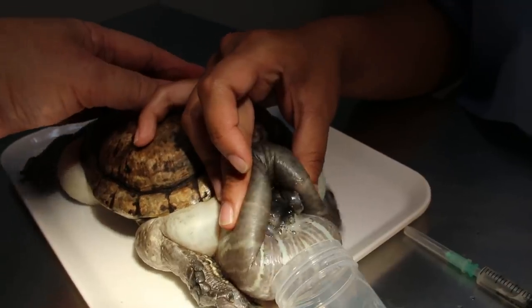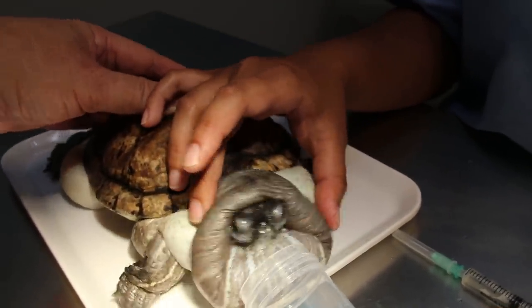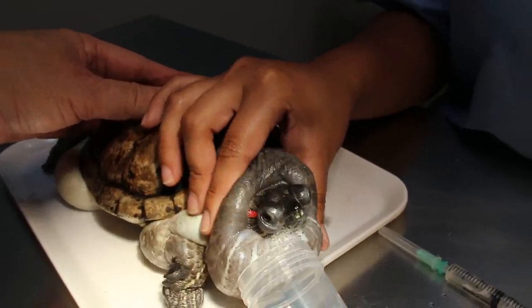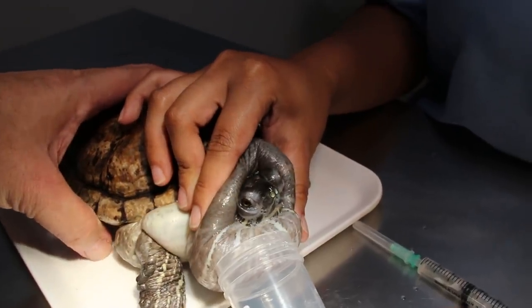Express it. Okay, stop. We'll take the needle again. Any more fluid? No more. There should be some more.